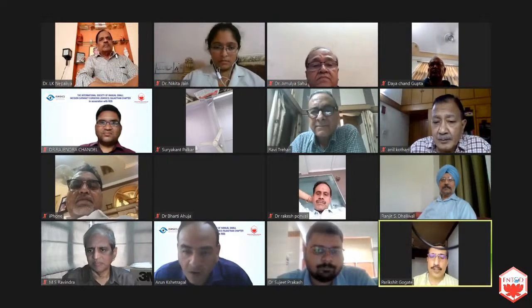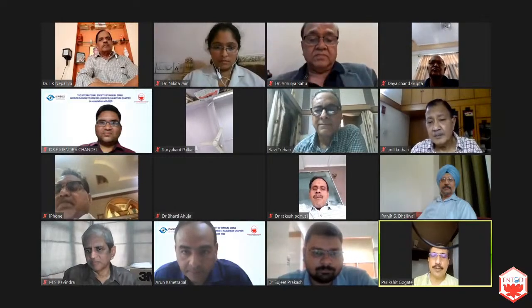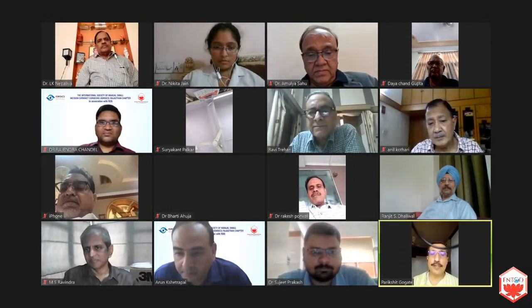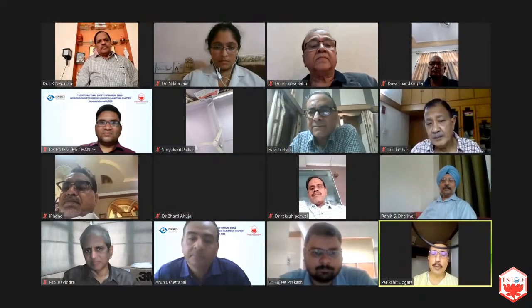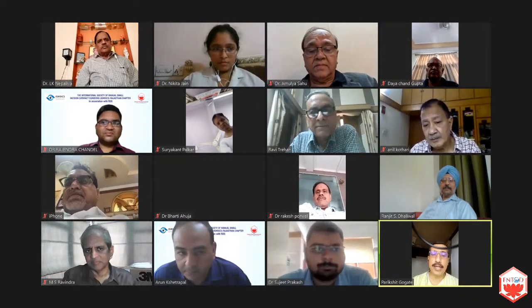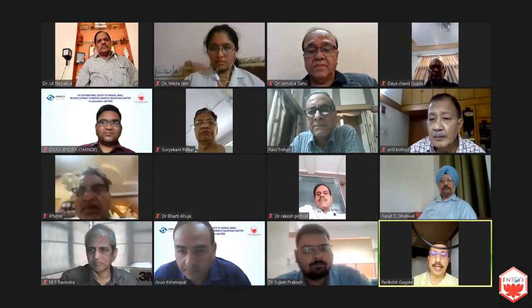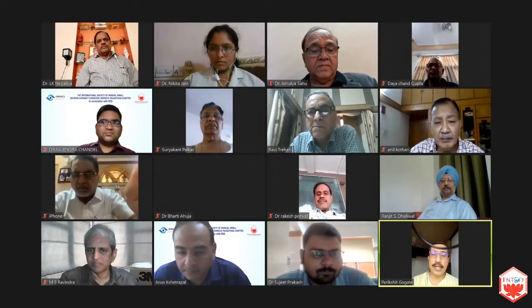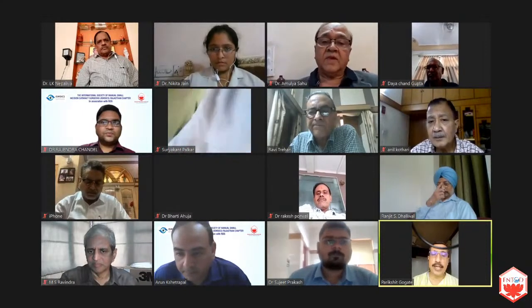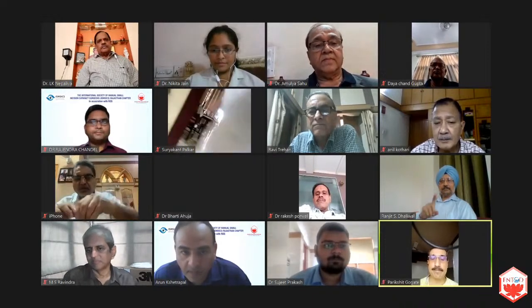So my technique is I do visco expression with a vectis or an irrigating vectis. What Dr. Sahu sir is saying is that using a Sinsky hook is dangerous. But then we know that while doing manual small incision cataract surgery, we have to be very careful of the endothelium whenever we are putting in an extra instrument. But like most techniques of manual SICS, it depends greatly on surgeon skill, and we have to be just more careful. Endothelium is something which is always at risk. So just use lots of visco is what I would say.